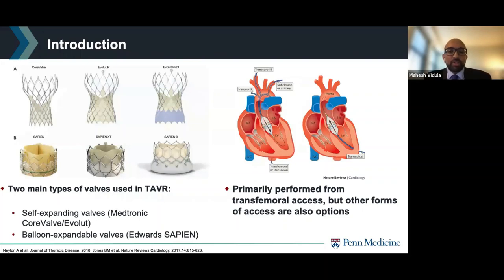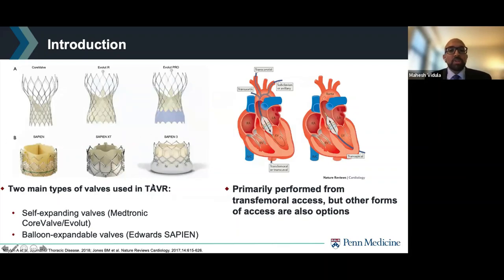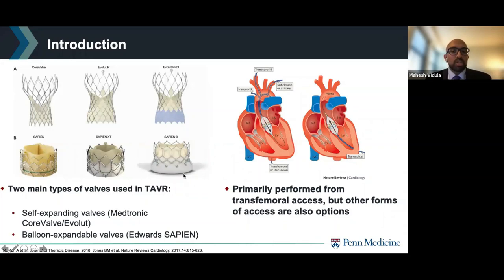There are two main types of valves used in TAVR. One is the self-expanding valves — the Medtronic CoreValve and Evolut valves. Two are the balloon expandable valves — the Edwards Sapien valves. The latest generation valves have a fabric skirt located where the valve interacts with the annulus, which provides a better seal and prevents paravalvular leak. In the Sapien III valve, the fabric skirt is mounted on the outside of the frame to minimize paravalvular leak.